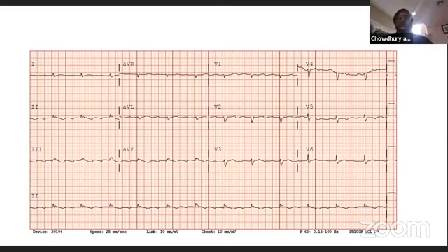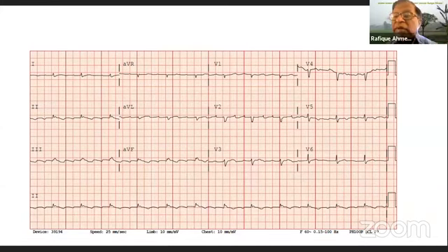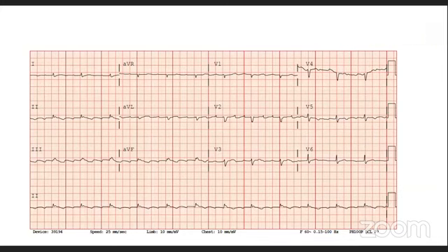Yes, exactly. So before that, please, what is the rhythm? Sir, it can be malignant pericardial effusion. No. What is the rhythm? You said the rate is 75, but what is the rhythm? Sir, the PR interval is a bit increased, sir. There will be first degree heart block.